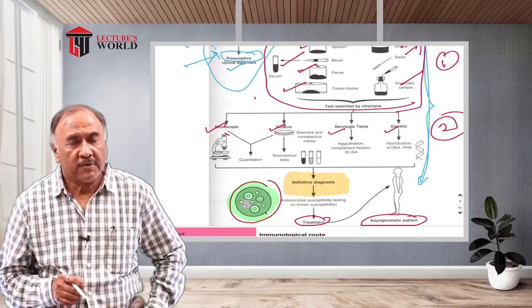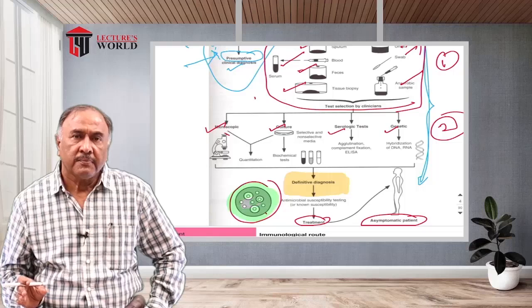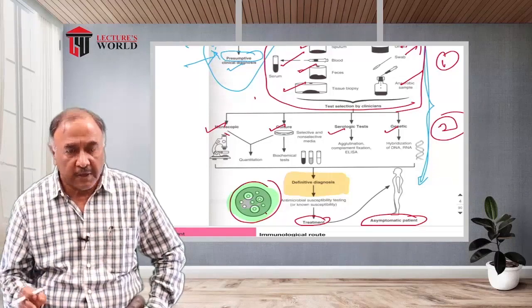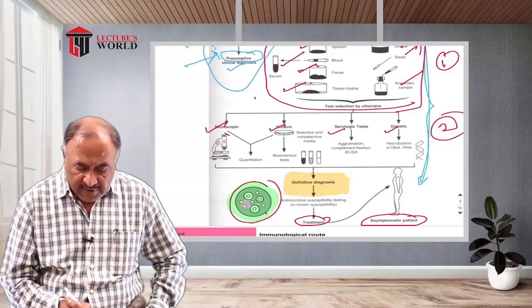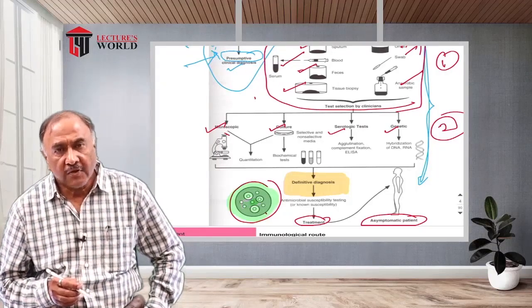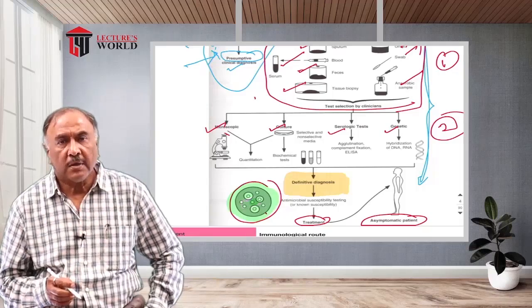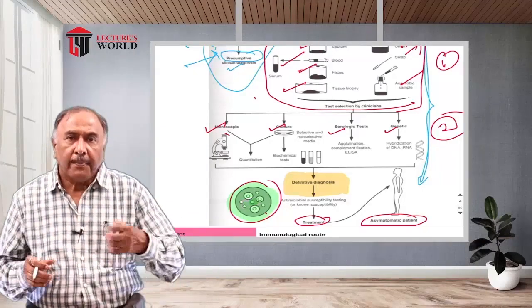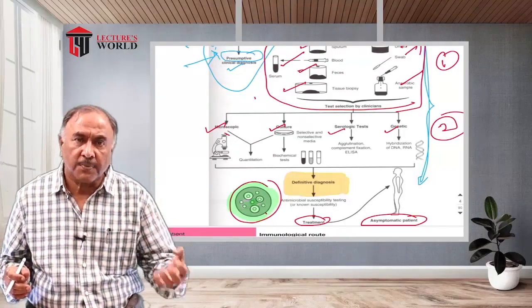Normally, when a pathogen is being identified, once the organism has been isolated, side by side, parallelly, sensitivity testing is also done in the laboratory. Now, why is it essential? Because sensitivity testing would guide the doctor to proper medications, proper drugs, proper antibiotics.